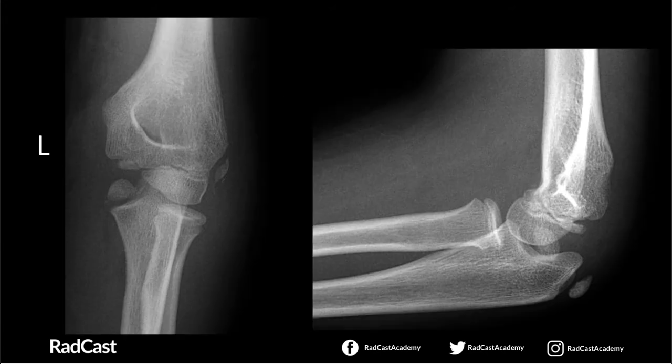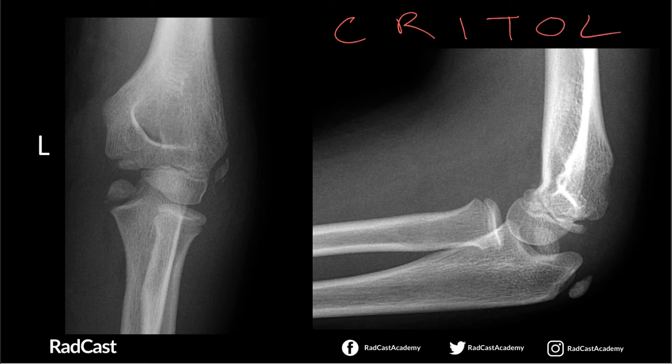Here are Wally's left elbow X-rays. On the left side of your screen you've got the frontal view; on the right side, the lateral view. Remember, Wally is 13 years old, so as per CRITOL, he should have all of his ossification centres. But remember, it's not so much about the age — it's the specific order in which the ossification centres appear. One cannot appear without the prior one already forming. Let's put that into action.